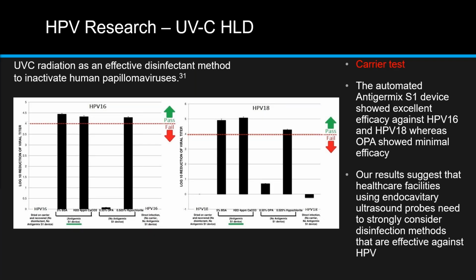And our results suggest that healthcare facilities using endocavitary ultrasound probes need to strongly consider disinfection methods that are effective against HPV. And I will point out that this study was done using discs that were made out of the same material that probe handles are made out of.